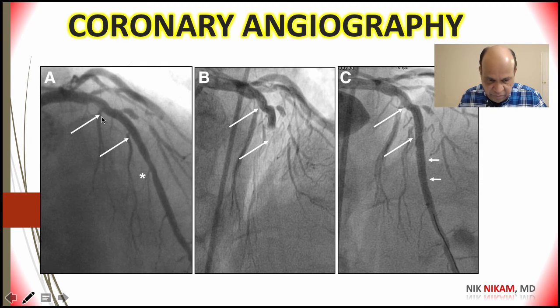Here is an example of another patient who, maybe during a procedure, develops acute coronary thrombosis. As you can see, there is critical stenosis in the diagonal branch, and this is the left anterior branch because we can see these septal perforators, and here is probably an old stent, I would say, and now we have acute stent thrombosis.